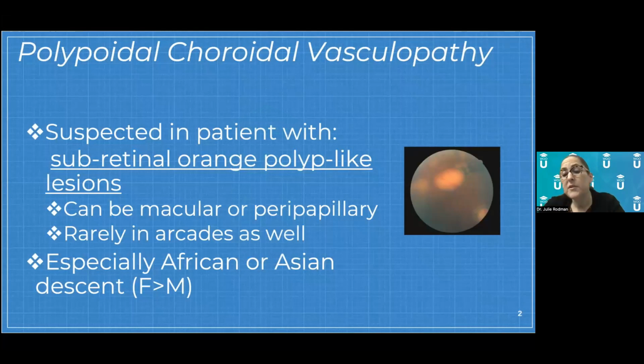So if you think about the pictures I showed at the very beginning, I showed you that there were varying stages or degrees of this presentation. There were some resolved lesions, some bleeding, some resolved lesions. That's the nature of what this disease does. It kind of comes and goes and comes and goes. And usually patients don't know that they have it until the macula is affected. And so when we see patients with these large PEDs or choroidal bleeding or subretinal bleeding, in African-American patients, we tend to kind of think along the lines, maybe that's polypoidal and not your regular AMD.